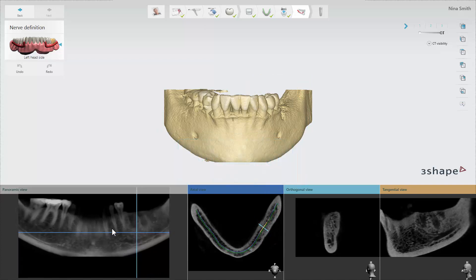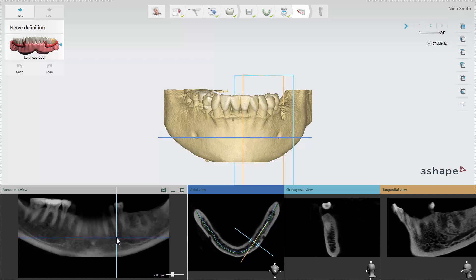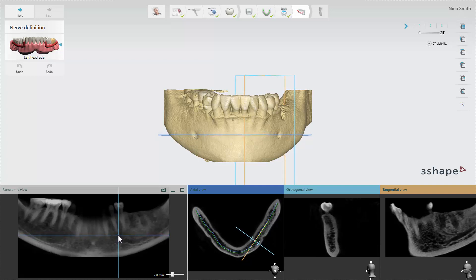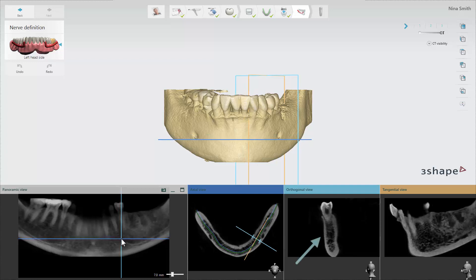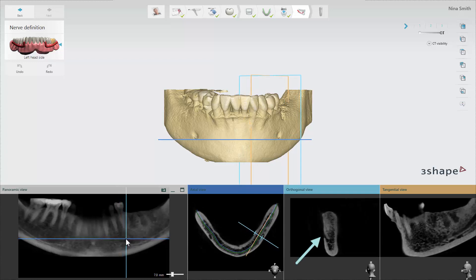In the panoramic view you should move the blue horizontal line down to where the exit points of the nerve canal are. You then switch to the orthogonal view where you hold down the control button and scroll through the scan to find the exit points.